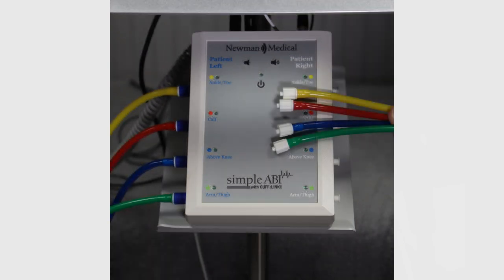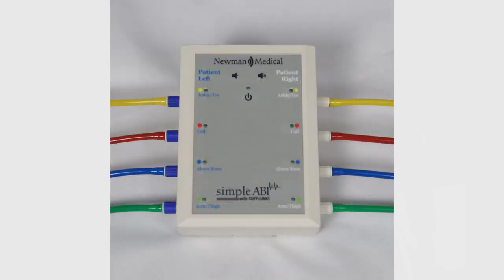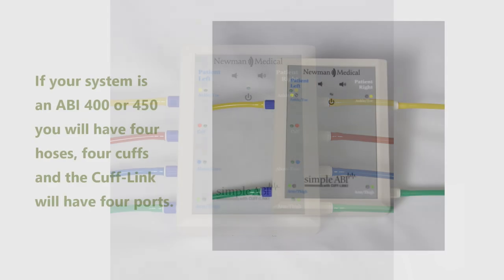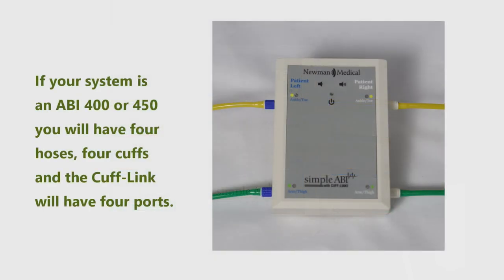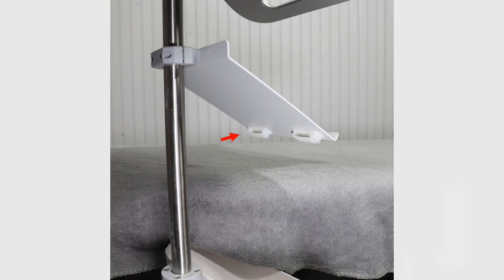Locate the white connector hoses for the right side of the cufflink. Connect the patient's right white connector hoses to the corresponding cufflink ports.